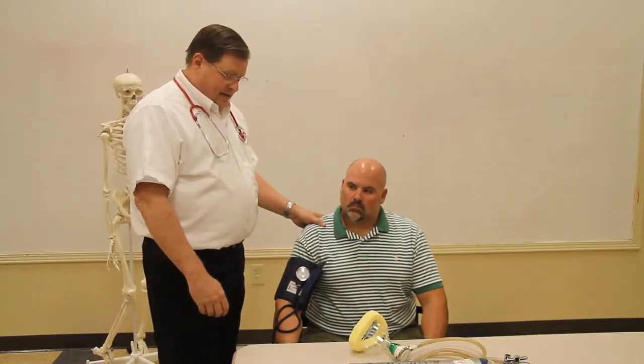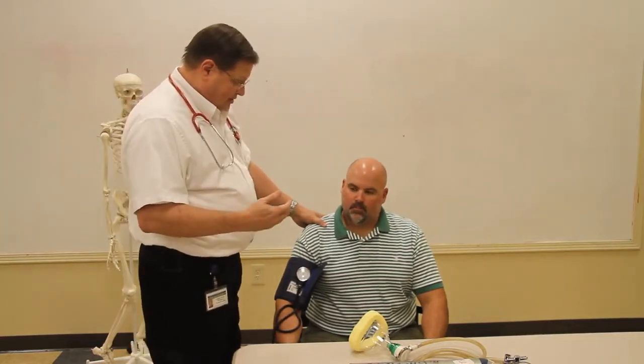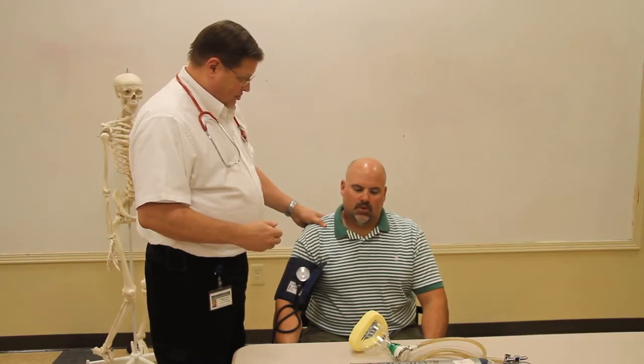On this particular patient, we're not going to have a particular injury, but I will ask a pain scale on that. Okay, Lee, what's your name? Lee. And how old are you, Lee? 40. Are you allergic to any medications or anything? None. Are you taking any medications? None.